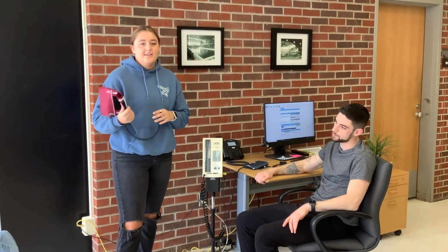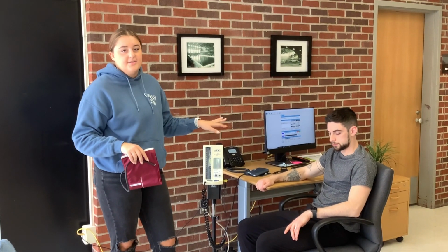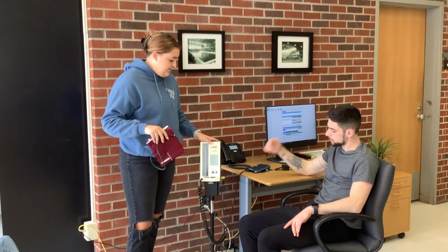All right, this is how to take a blood pressure measurement. So the first thing is that at this point, the participant has been answering questions on the computer just to kind of let their blood pressure decrease from walking in. This is the blood pressure machine.